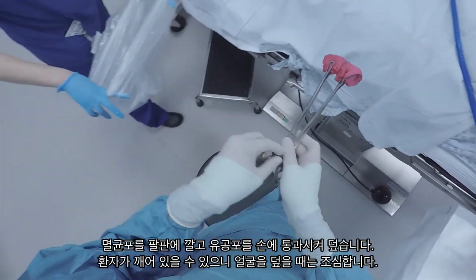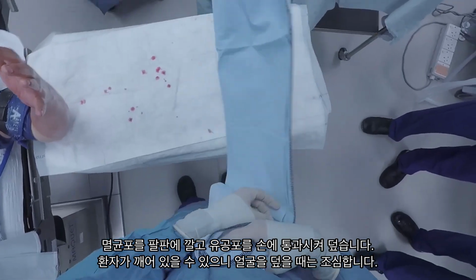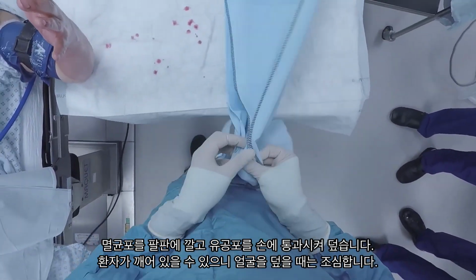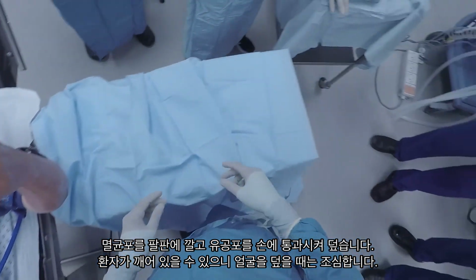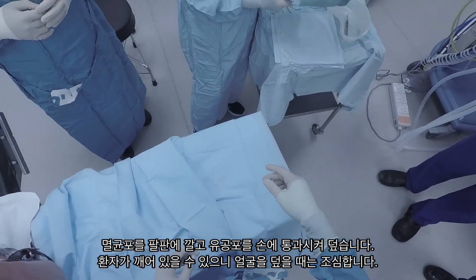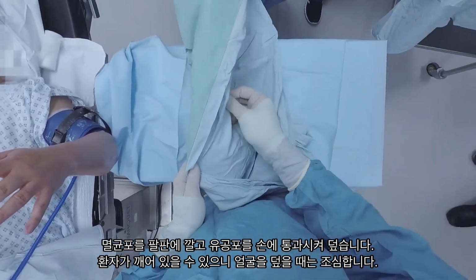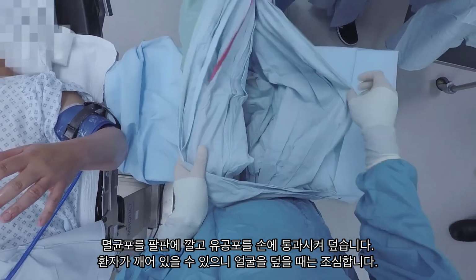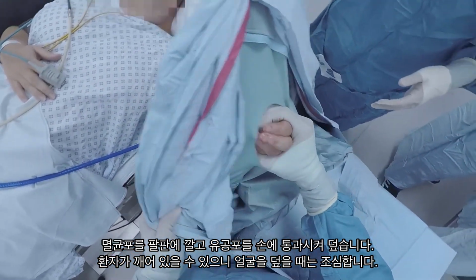Throw out your swabs, and whilst keeping the patient's arm up, put a sterile drape on the arm board. If you have a fenestrated drape like this, grab the hand through the hole and put the drape over the patient. Remember that they may be awake, so just be a bit careful when putting it over their face, as you don't want to smother them with it.